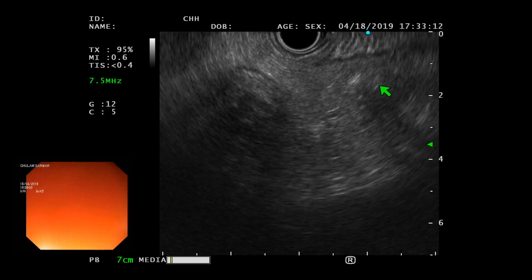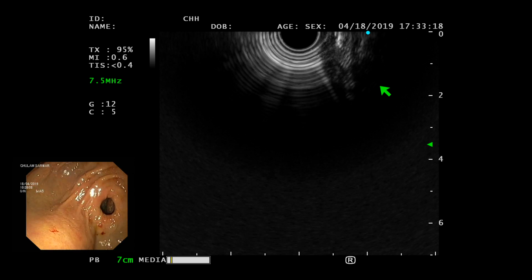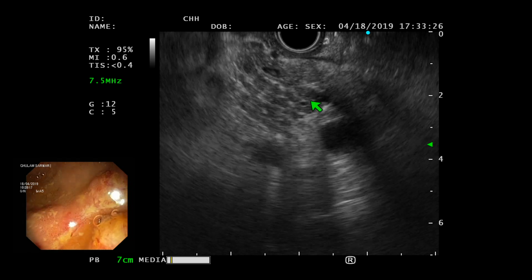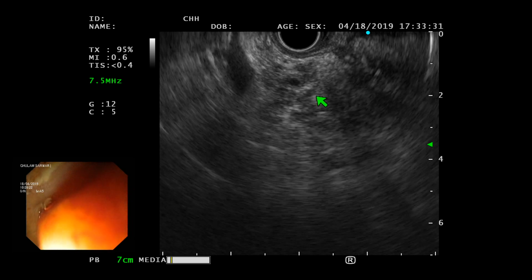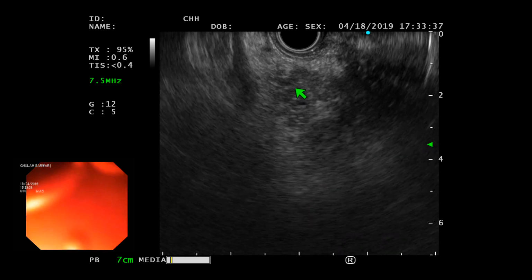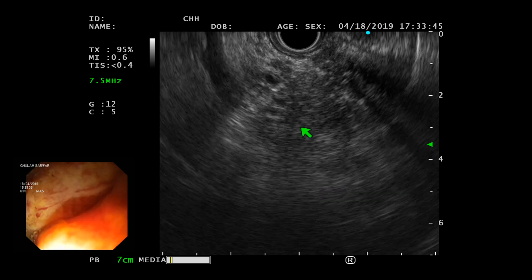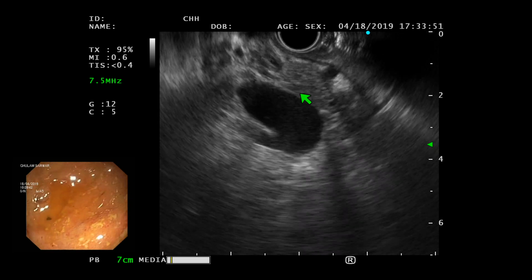So if it was a divisum, one more time, I go in here, I find the bile duct. Bile duct would be coming right here. I won't see this pancreatic duct right underneath the bile duct. Right now, I'm right at the ampulla. Actually, I see the bile duct right now better in D1 as well. So this is getting close to the ampullary area. Here, the pancreatic duct, when coming from here, will go upwards there, and the bile duct would open separately right here. So that's how you would see that.